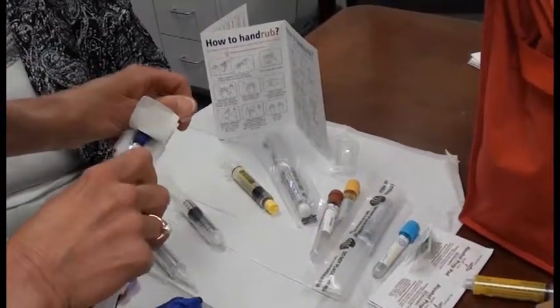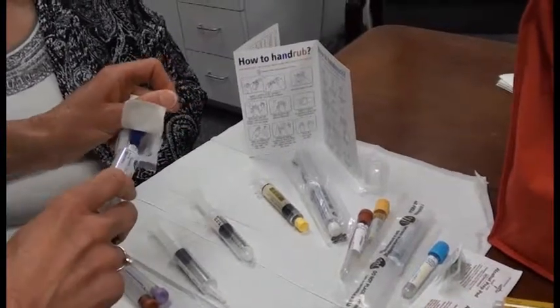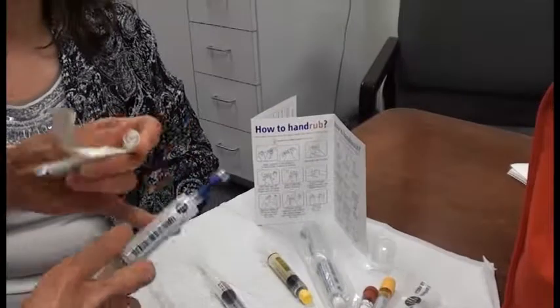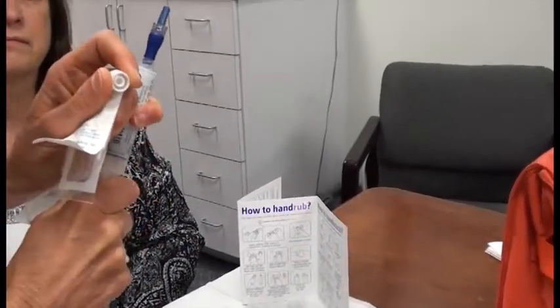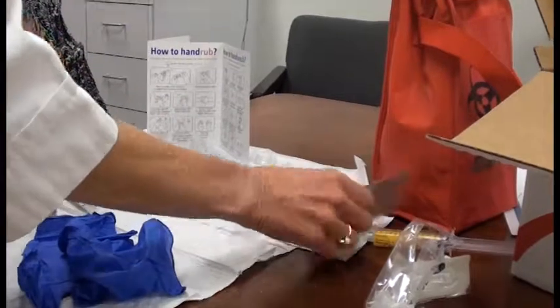Now, would you have washed your hands before that time? I did when I started, sorry. I was setting up stuff over here. So we started with clean hands, and we'll just flush that cap and get it ready. So when it comes time for the cap change, we'll be ready to go.